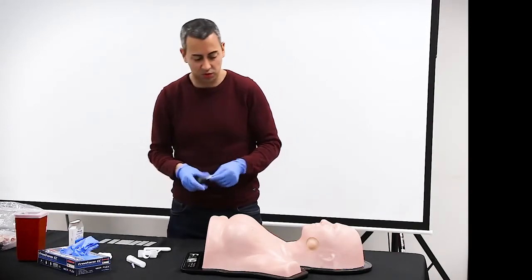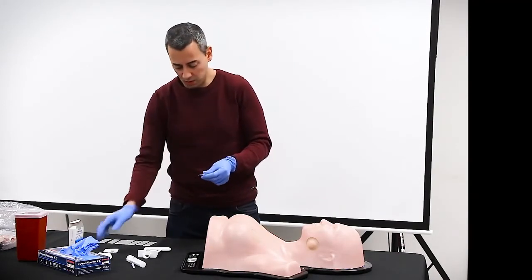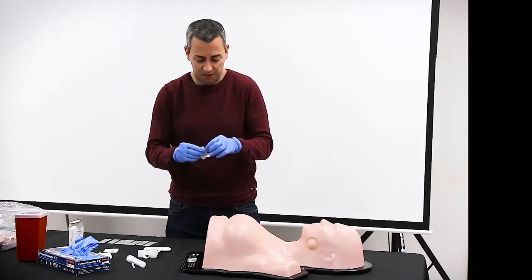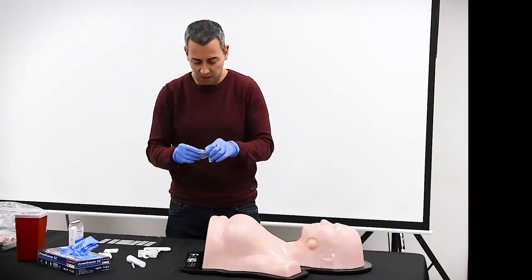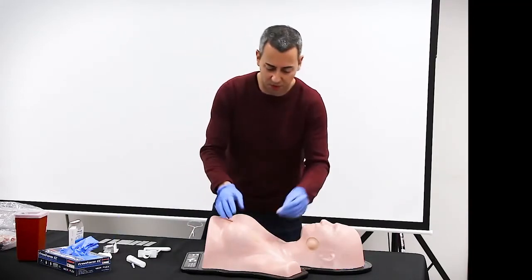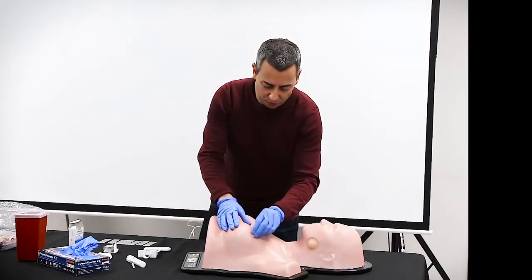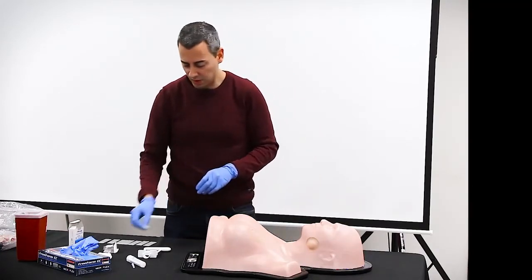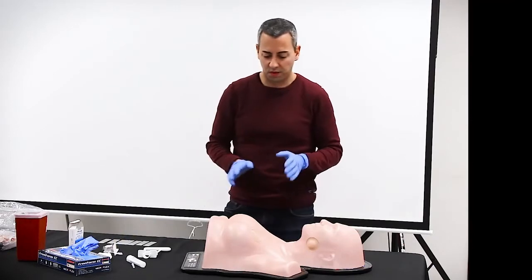So now they have to clean the area with an alcohol swab, it is enough. You don't have to use povidone, an alcohol swab is enough. So you have to clean the surface. So now it's ready to perform the procedure.